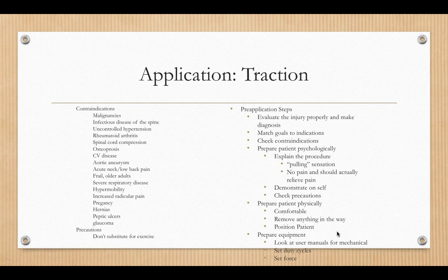Make sure that, again, the patient is comfortable, that the straps aren't hurting them, or that your hand placement isn't hurting them. If you're doing manual, trust is a big thing too. You're going to be, especially with cervical, holding their head. So gain that trust for them. Let them relax into that position before you start.